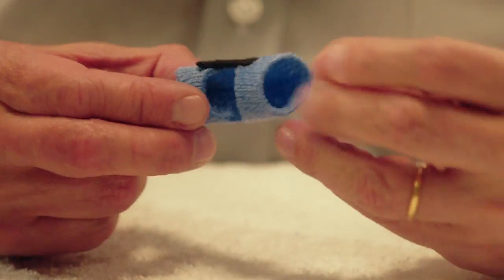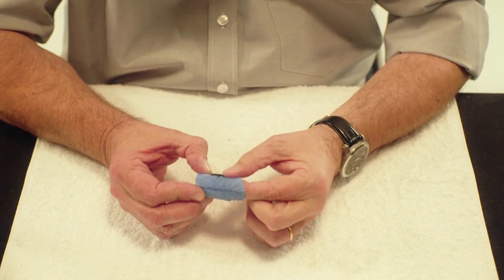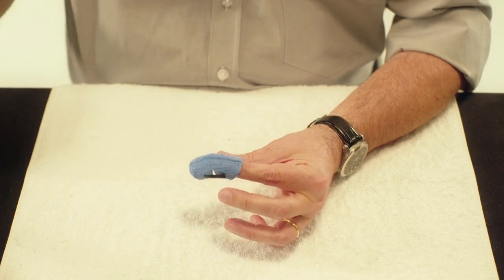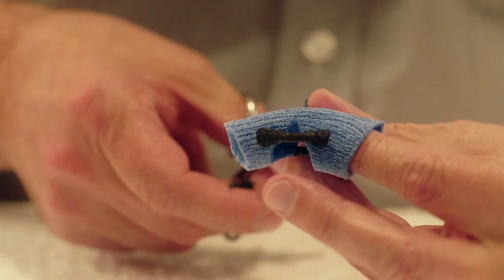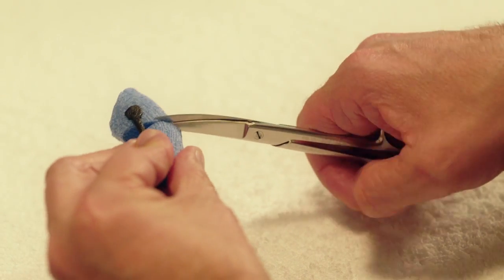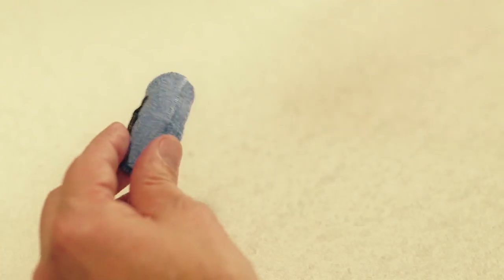Repeat the same for the other side. Finally, cut the finger base of the orthosis in two by cutting from the tip of one lateral V over the dorsal side to the tip of the other V, thus enabling flexion.